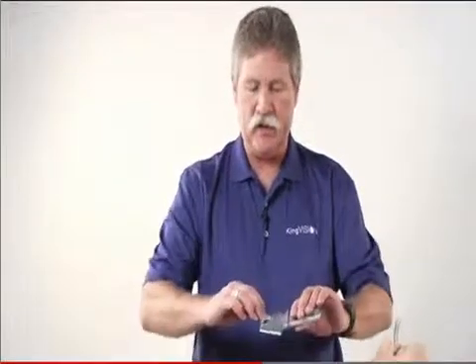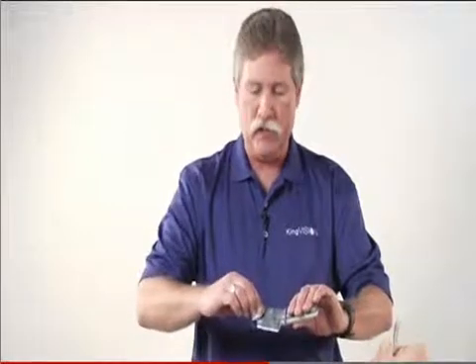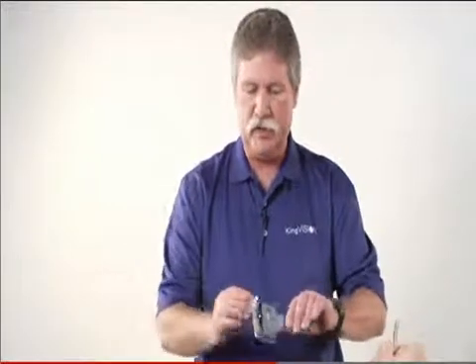Now typically, because you're handling the blade and you don't have much patient contact, it's just wiped down with an isopropyl alcohol wipe between uses. And clearly this would just be a matter of wiping down, and you make sure that particularly on the power button, the crevices there, any places where it might have been handled, that you wipe that down. And typically this would be a totally acceptable way to disinfect this between uses.